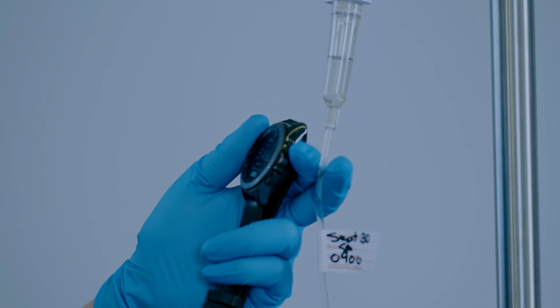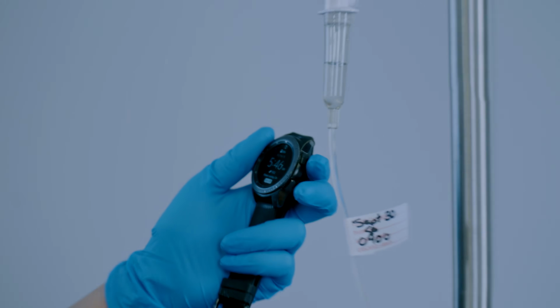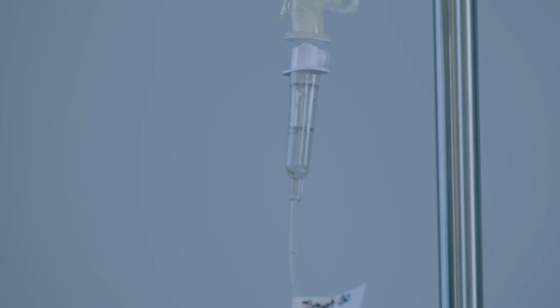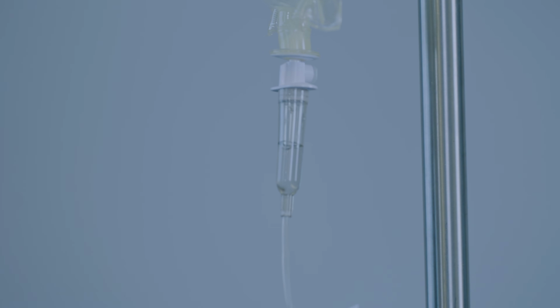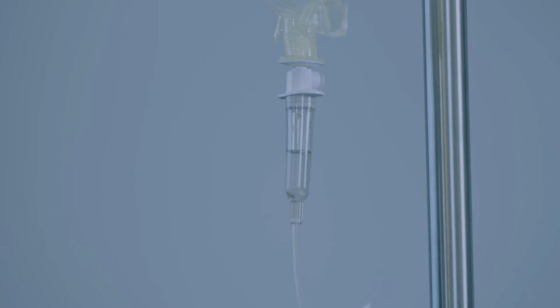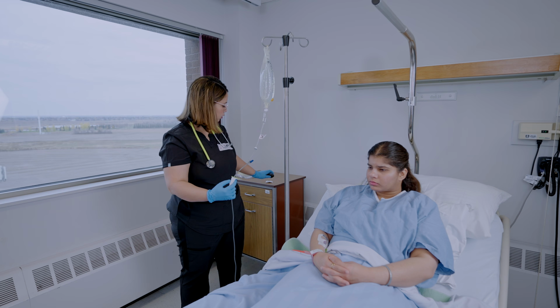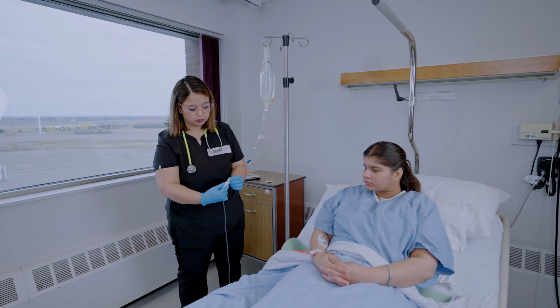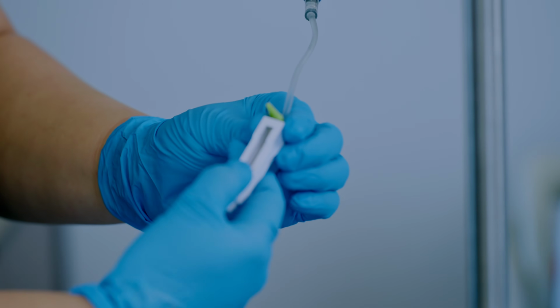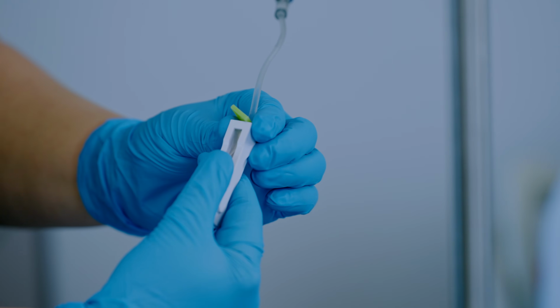How can you do that? You can do that just by counting those drops which are falling in the drip chamber. For example, 1, 2, 3, 4, and you can see it's going a little fast or a little slow. So what you need to do is adjust your roller clamp. If it's too fast, you can tighten it up. If it's slow, you can open it up, and then make sure that you're getting exactly 21 drops per minute.